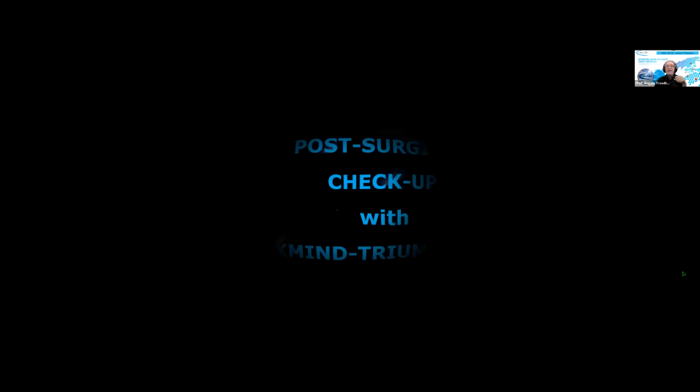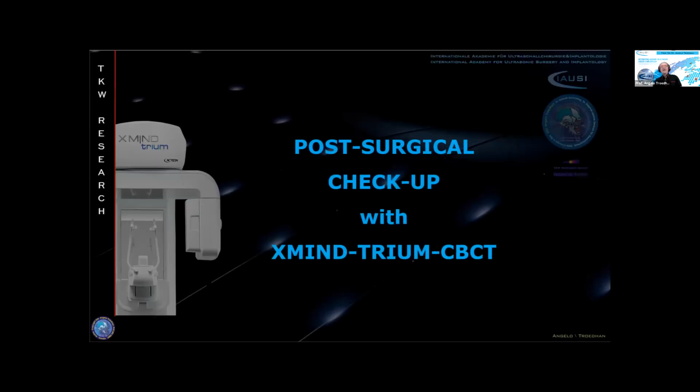Yeah, but what I wanted to tell you is that if there is a little gap open, this will heal by secondary intention. Most of the times, it's only about 1, maximum 2 millimeters. And within 1 or 2 weeks, if the patient does not rinse too extensively like this, or goes over the side with the toothbrush, you don't have to worry about secondary intention, as you don't worry when you just do a simple tooth extraction of a molar where the gap is much wider, because it's filled with a blood clot, and it will heal by secondary intention.